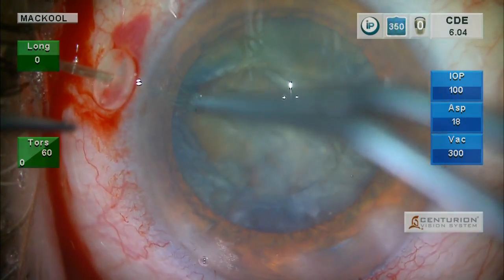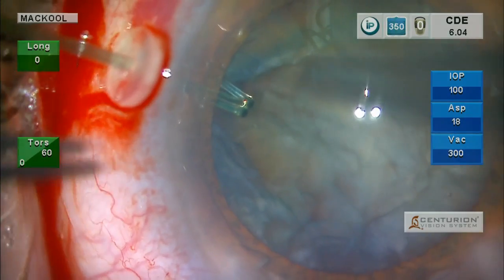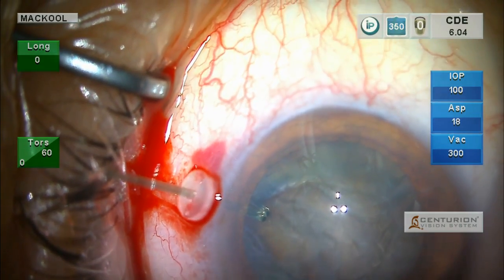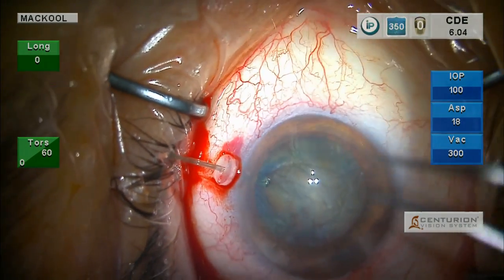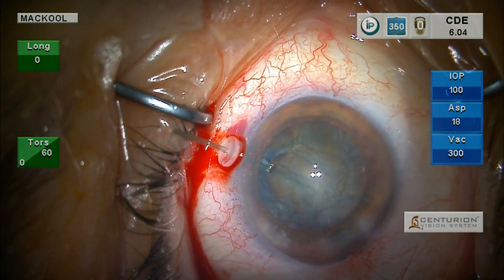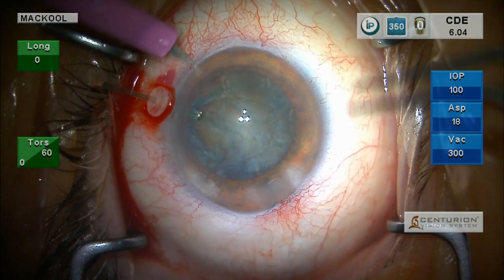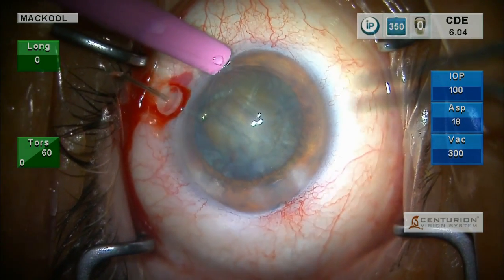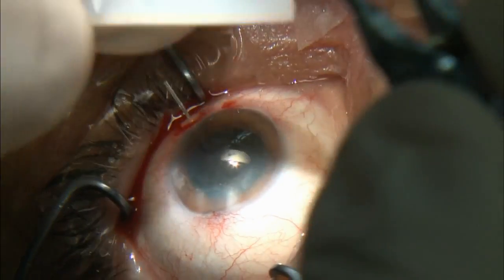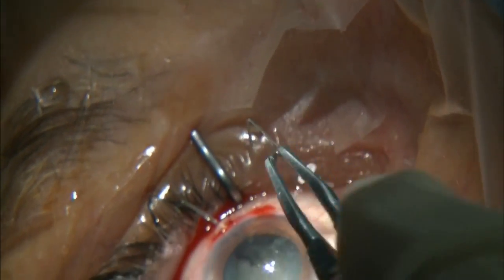The capsule goes right to the retractor, but it's the tip of the retractor in the capsular fornix that's really doing the heavy lifting — that's what's really giving us the support. Now I'm going to put one here and then possibly one here. When we're done, we'll be injecting a capsular tension ring. My feeling is that anytime I'm concerned enough about the zonule to use these retractors, I'm going to use the capsular tension ring.